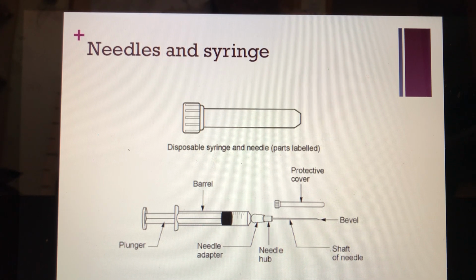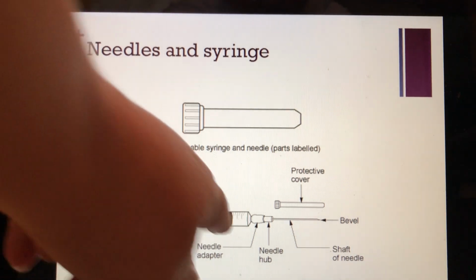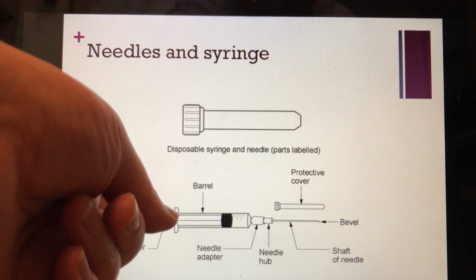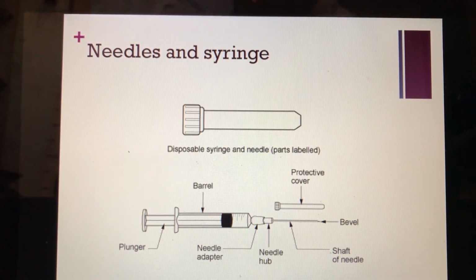Unfortunately, I don't think they're recyclable, which is a shame because it would be good to be able to recycle these. You go through so many. So we have our syringe. We have different parts labeled on the syringe here. So the barrel, that's the part that has the numbers on it for measuring how much volume you're drawing up. Then the plunger is the portion that you're pushing on to inject the medication, or pulling on to get medication into that syringe.